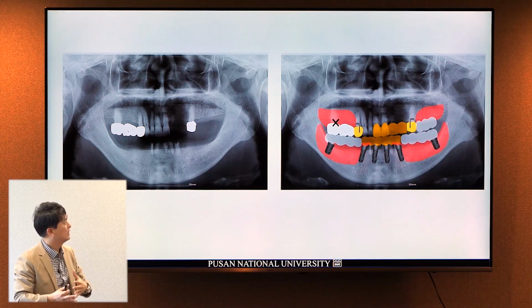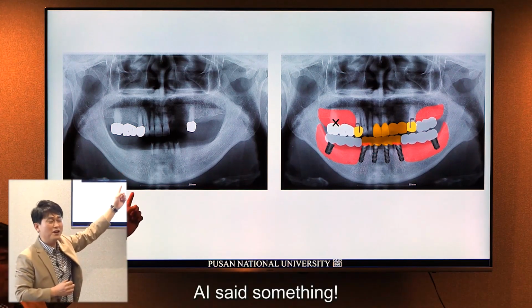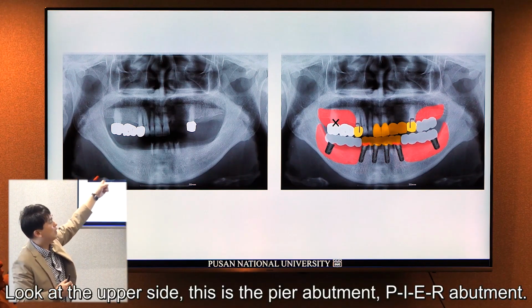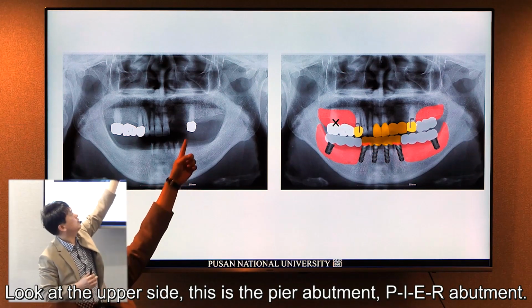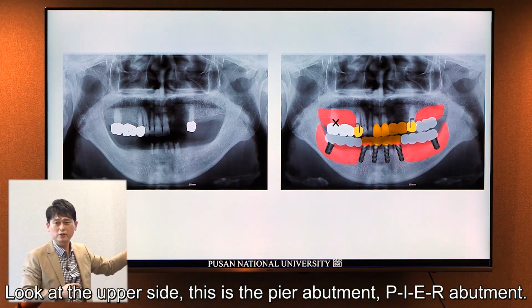What's the reason? Look at the upper side. This is the pier abutment, P-I-E-R, pier abutment.